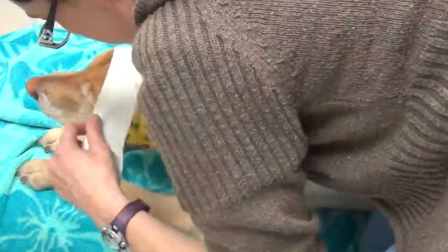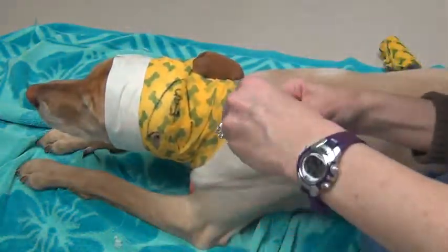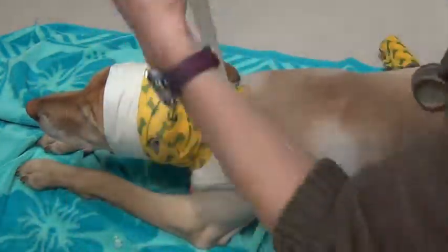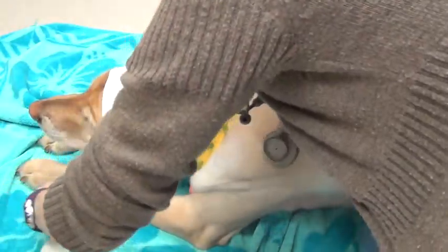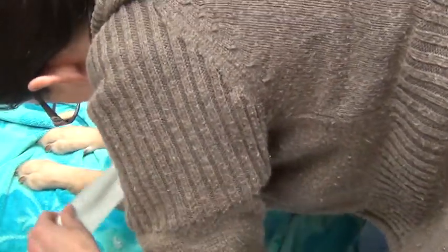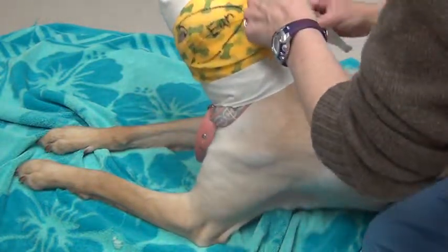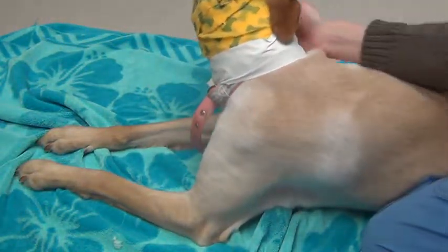It is super cute on her. That sweet big girl. And this is just going to keep it from sliding too. Alright, sweet girl. So lift your head, make sure we get a good contact with the bandage in her fur. Alright, that concludes the application of the ear hematoma bandage.